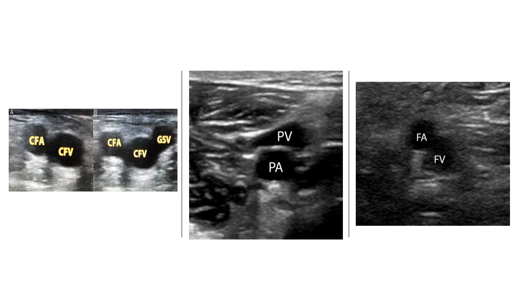Here is what our transverse pictures should look like throughout the upper part of the leg. We're not going to spend much time talking about scanning the calf because that's something that we just kind of have to do in person. And you're going to see tech struggle with that even in the clinical world. So you will probably learn it in clinic before we spend a ton of time learning it in class and in lab, but we will get there.